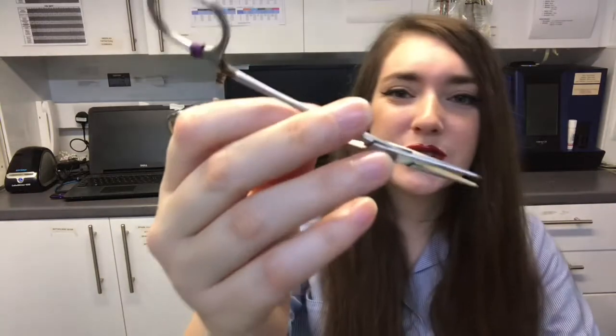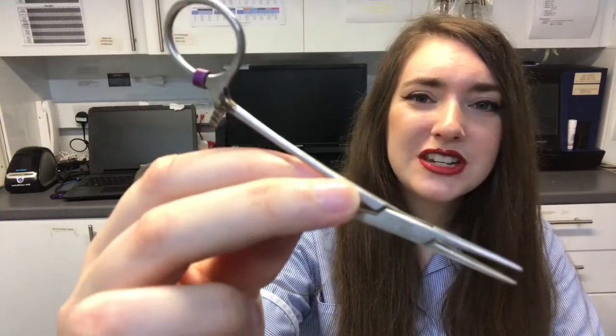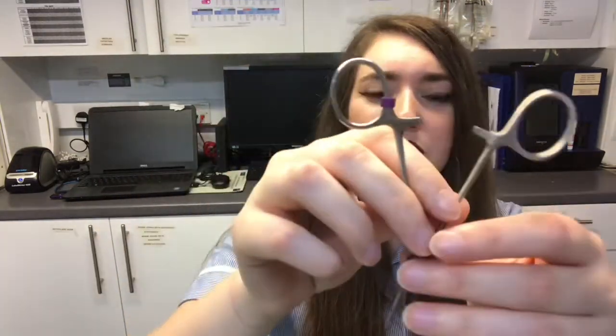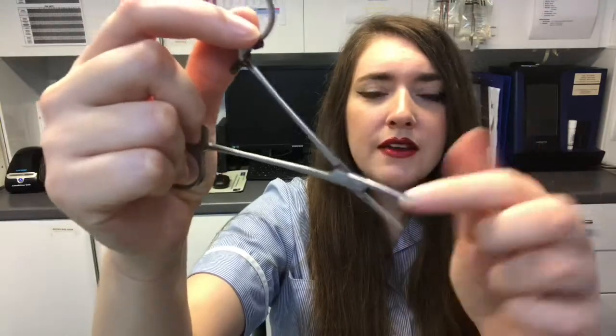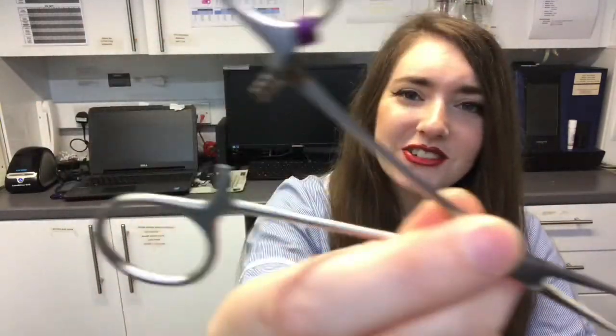I'm going to show you some instruments you're going to need for a cat spay kit. The first instrument is some straight forceps. This holds the tissue in place and also compresses any vessels or arteries that may be bleeding. Leave it open so it can be cleaned in all areas. That's your straight forceps.